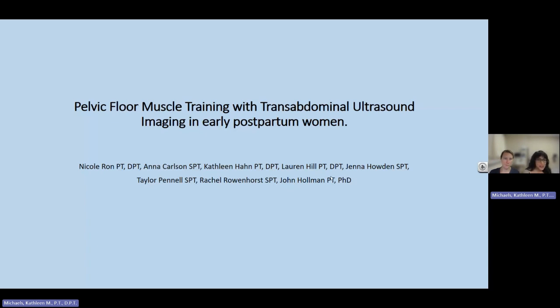But what we found particularly interesting is that there were greater improvements demonstrated by participants who began with negative or paradoxical bladder excursion at baseline testing. So participants that had the greatest challenge initially performing pelvic floor or Kegel contractions showed the greatest degree of progress.